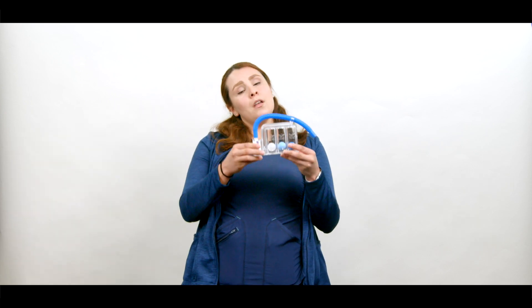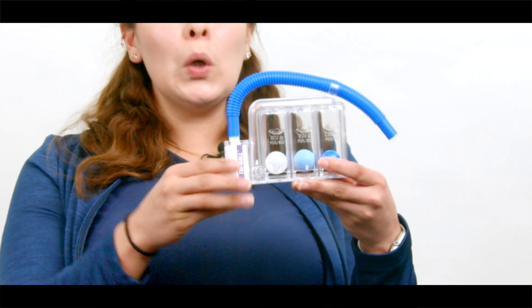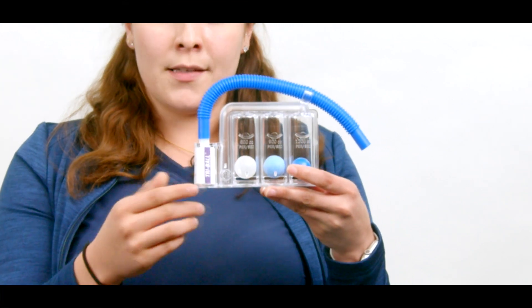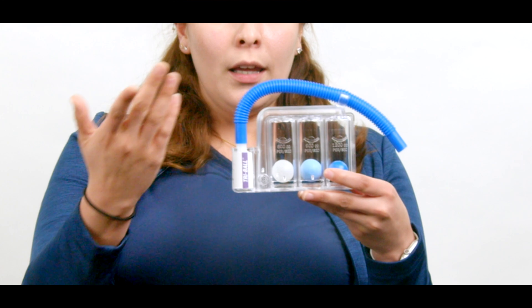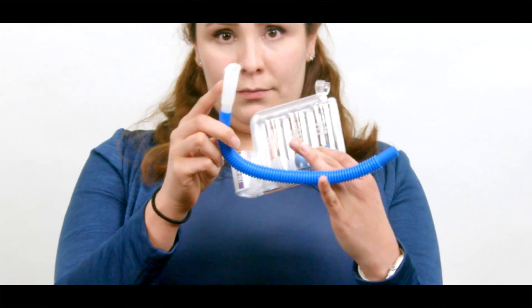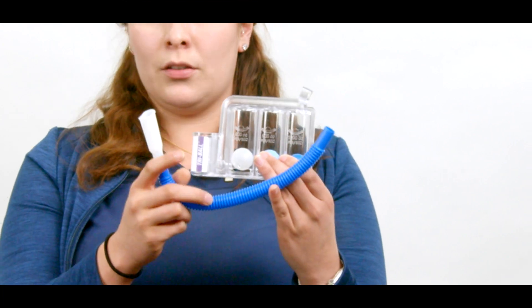There are different types of incentive spirometers, and this is the one you're going to get here at OCC. This spirometer consists of a breathing tube, an air chamber, and on the breathing tube you're going to find the mouthpiece — this is the place where you put your mouth.